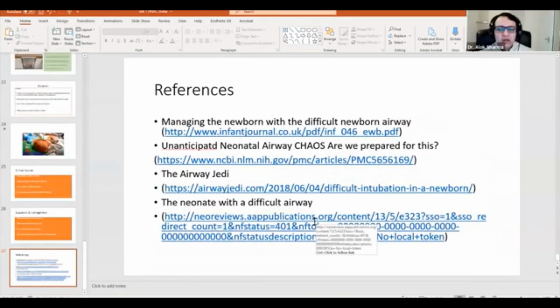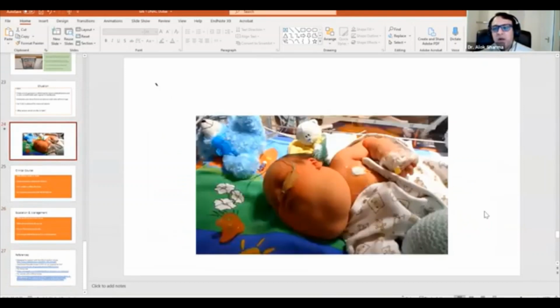Yeah. So we didn't have to do anything. The baby came out and was breathing without any problems. As you can see, we put a nasogastric tube down. The baby started some high flow and adapted. But in order to take this baby for surgery, we had to develop a pathway for management of this baby. So this baby was intubatable with a broad blade, and it was intubated by my pediatric anesthetic colleague using a broad blade. I will be showing that to you in the next talk.